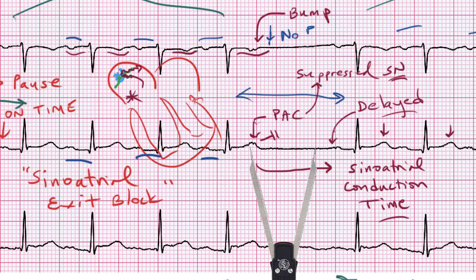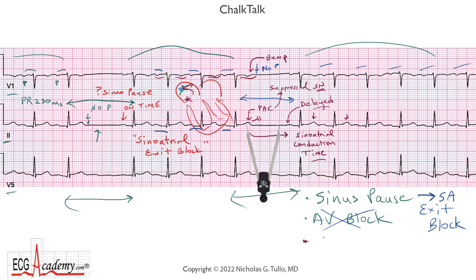What we're really dealing with is a blocked PAC resulting in a pause that resembles a sinus pause, but it's really not. The third possibility I conveniently left out is a non-conducted or blocked PAC — and that's what we have here. We have frequent PACs that are so early that the AV node fails to conduct them because it's refractory. Here it is again — you can see it's superimposed on the T wave, and because it's so early the AV node fails to conduct it. It's a very common arrhythmia. You really need to look for these P waves because if you don't look for them, you won't find them.